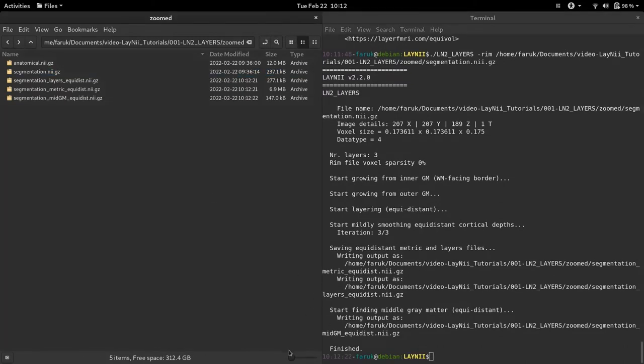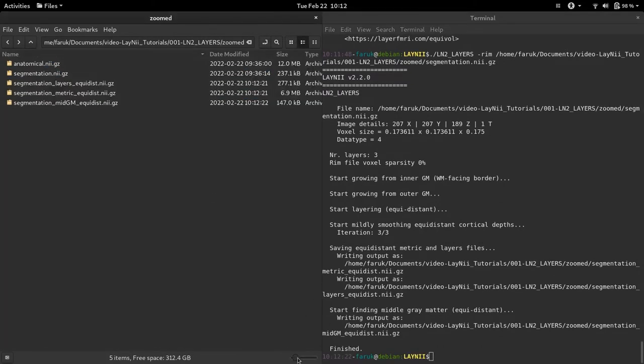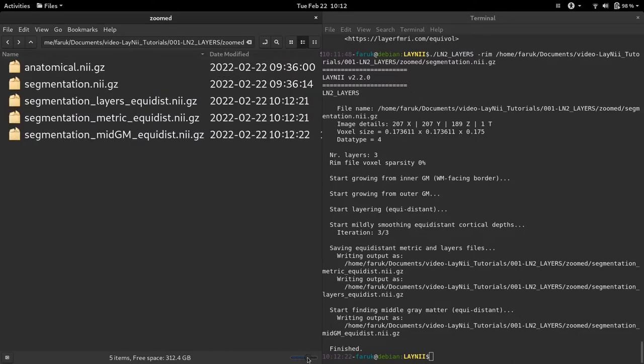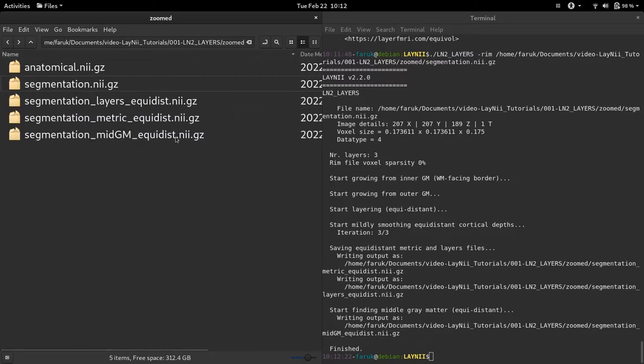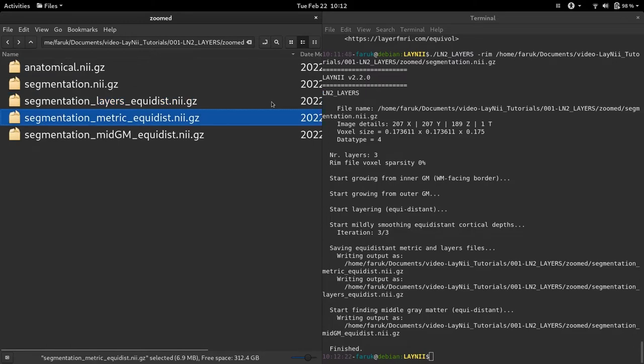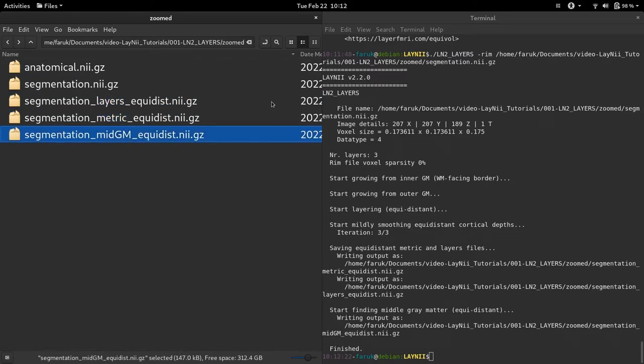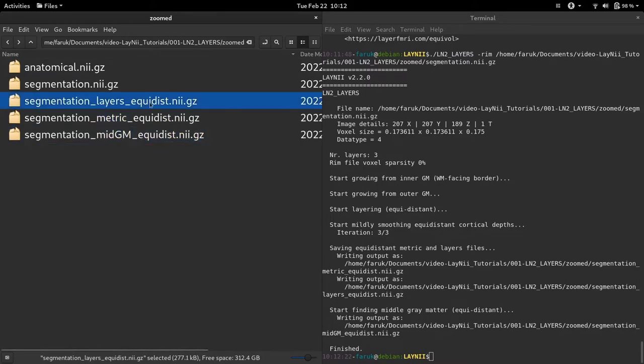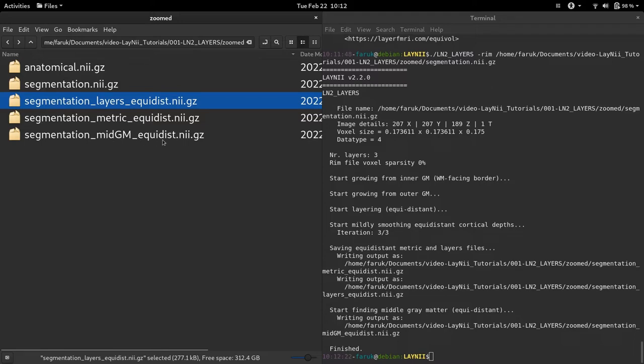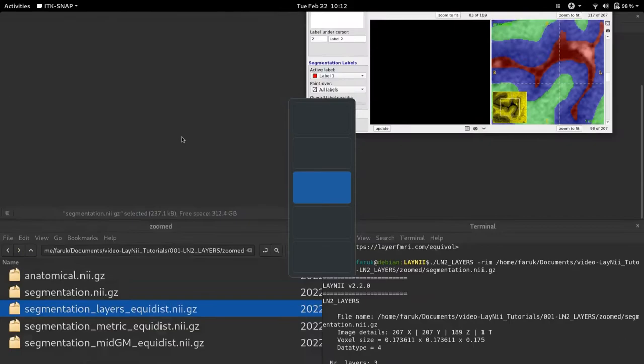So now what you see is that there are three new outputs generated. One is called layers equidist standing for equidistant measurement. The other one is called metric and the other one is called mid gray matter. Now let's have a look at these outputs.